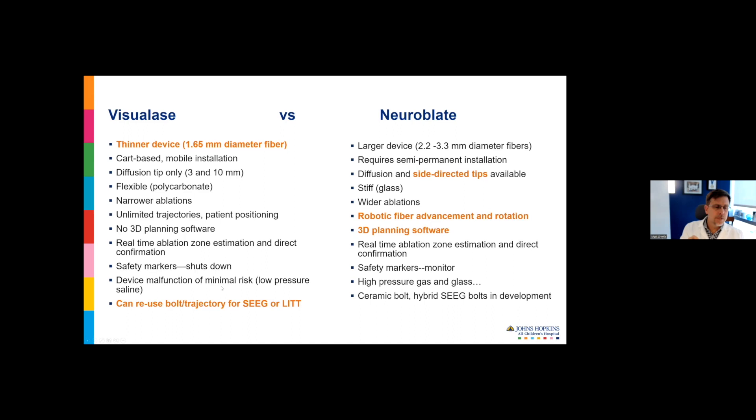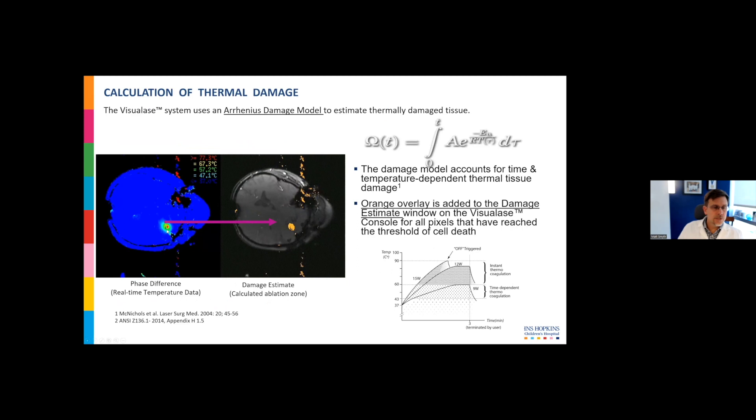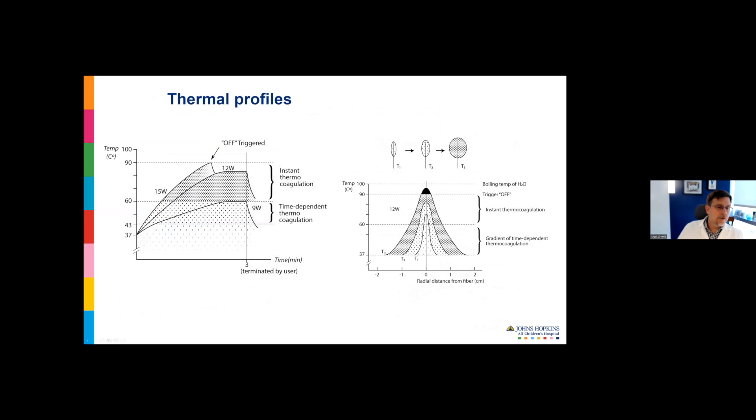This is what the thermometry looks like on a Visualase case. You can see the laser heat depositing during a run of ablation, and this is a thermal damage map being created. If you heat any part of the brain above 60 degrees, you have instant thermocoagulation. If you're below 43 degrees, you have reversible thermal injury. Between 43 and 60, dependent on time, you have irreversible thermal injury with protein denaturation and cell wall breakdown.